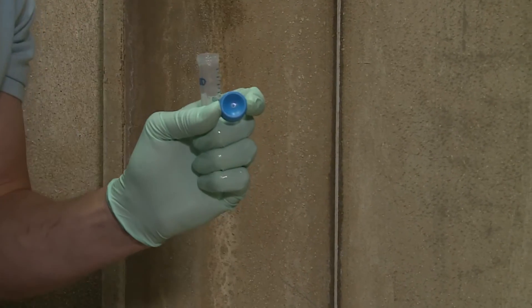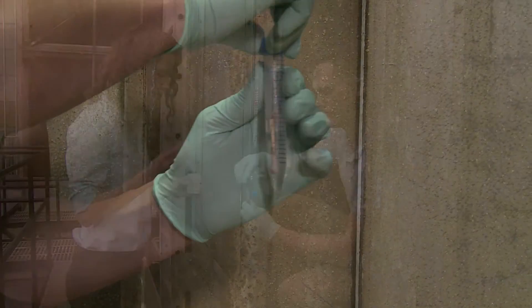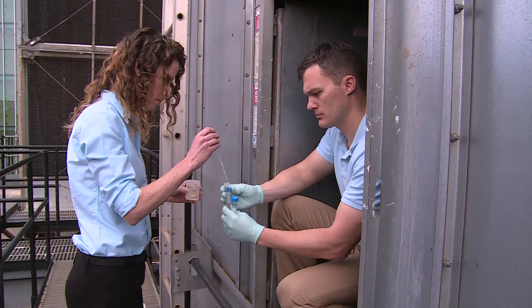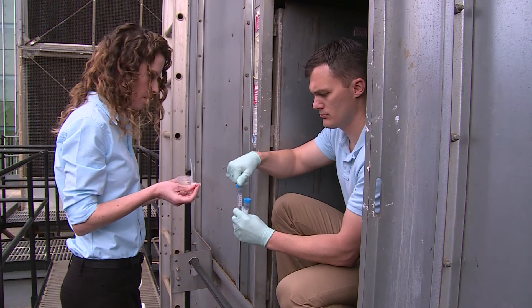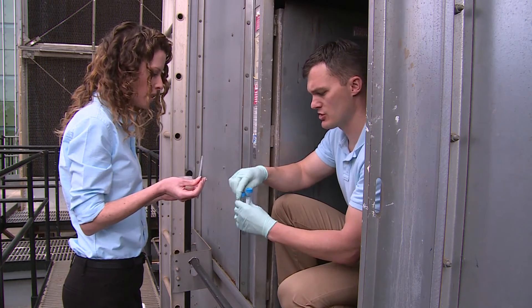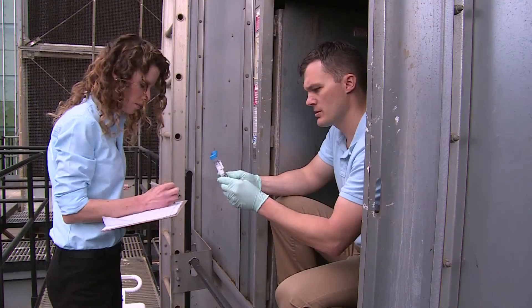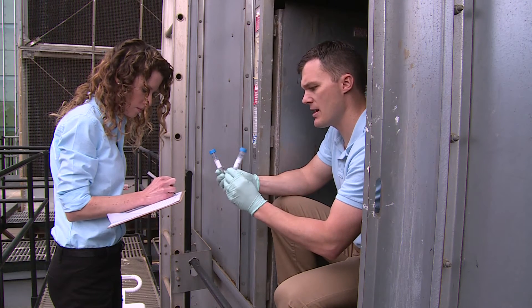Place the swab into the tube. Snap the stem about one inch from the top of the tube. Add a drop of 0.1 normal sodium thiosulfate solution to neutralize residual disinfectants. Tighten the top to prevent leakage. Then label the tube with a unique identifier and record it on the sample data sheet. Place the tube into the cooler for storage and transportation.